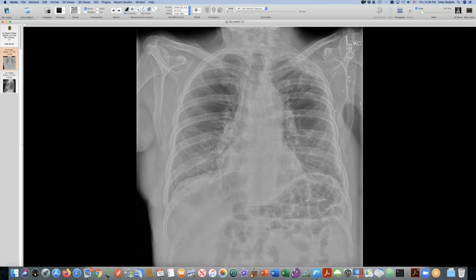So 60 centigrade is a big dose, I'm told, and I think they limit mediastinal radiation to 30 or 40. This is 60. That's quite a bit, and you would expect some effect on bone. So radionecrosis. So nicely done, Travis. David, do you think it was 60 gray and not centigrade? Yes, I think it was 60 gray. Okay, yeah, because that's right. I think for standard radiation, it was like 60 gray for lung cancer, and I think for SBRT, it's even higher to a very small area. But that's a pretty big dose to bone.